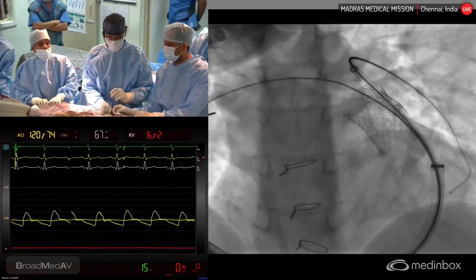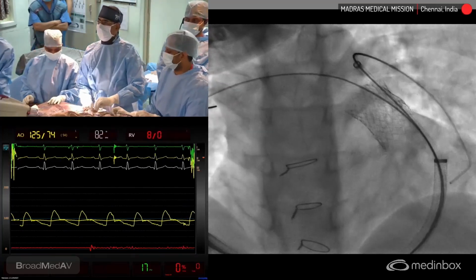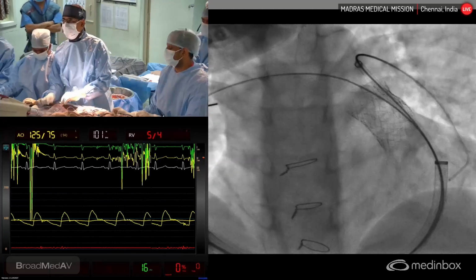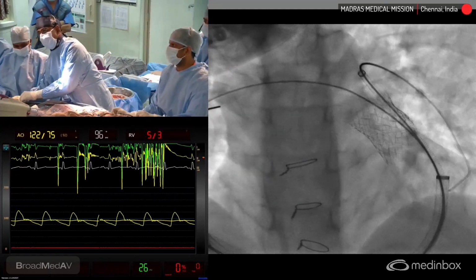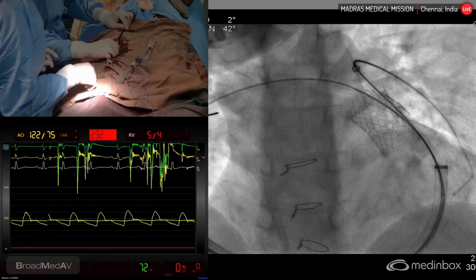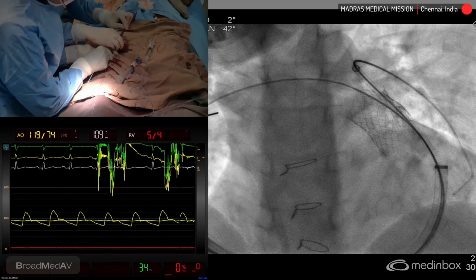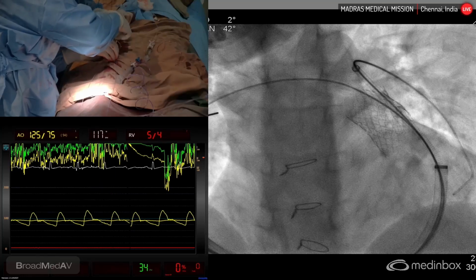Hold the... I'm now taking the dilator out. Let's position a 10 into 20 formula stent on this now. 10 into 20 formula stent. I am de-airing this sheath.